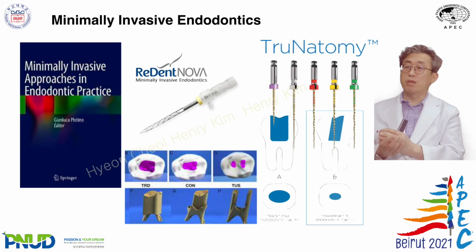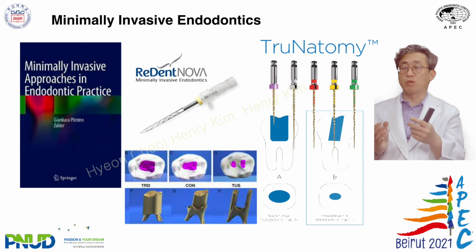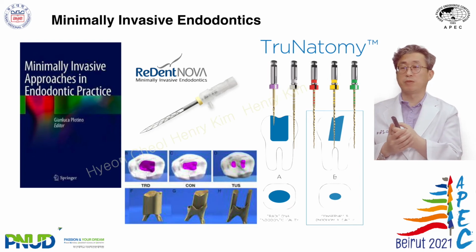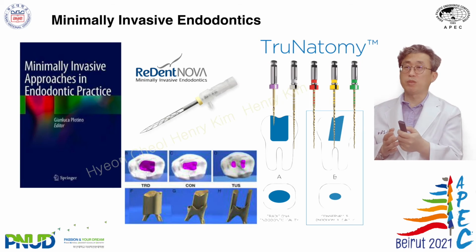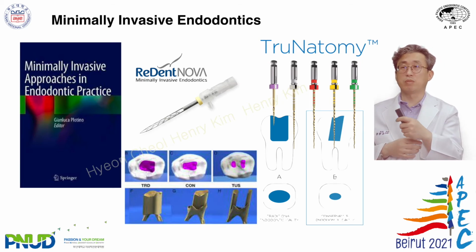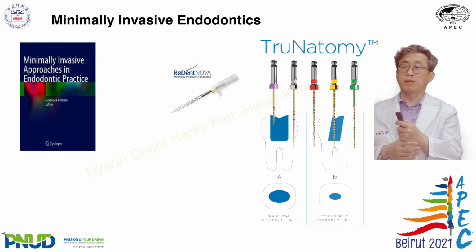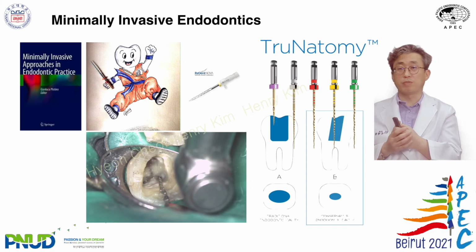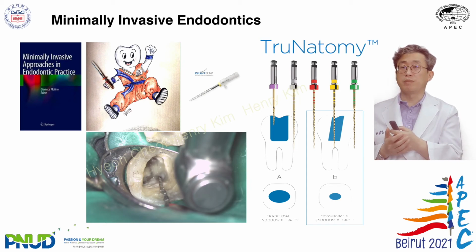In our contemporary endodontics, minimally invasive procedures are quite popular, as in dentistry generally. We are all pursuing minimal invasiveness, not only for the access cavity, but also for the shaping instrument. We can select any file brand, including single file systems, to shape the main canal to a minimal size.